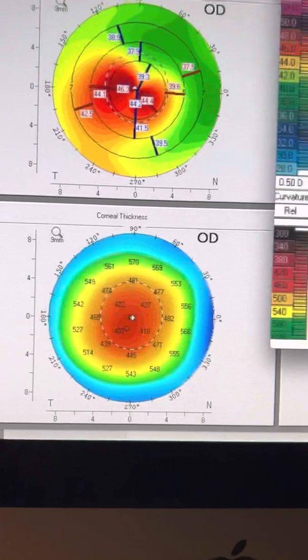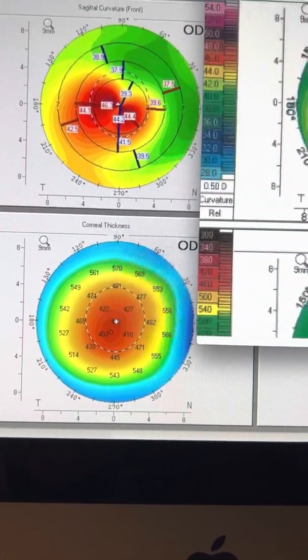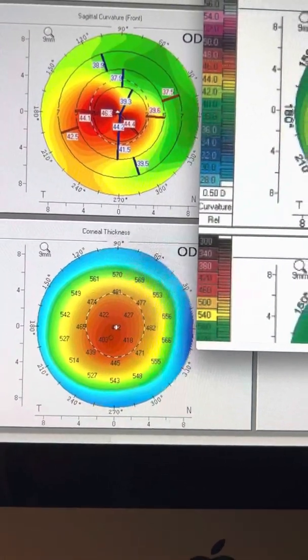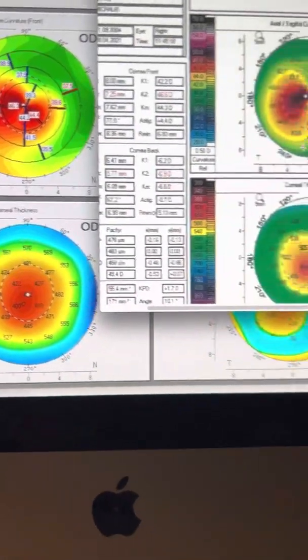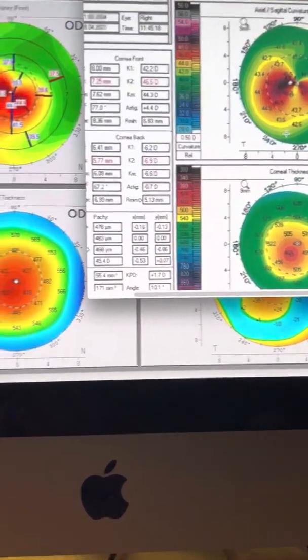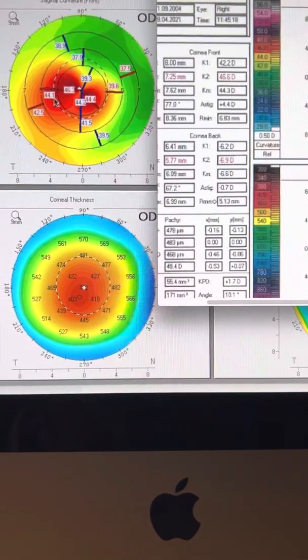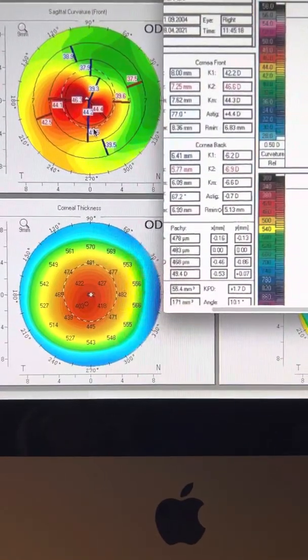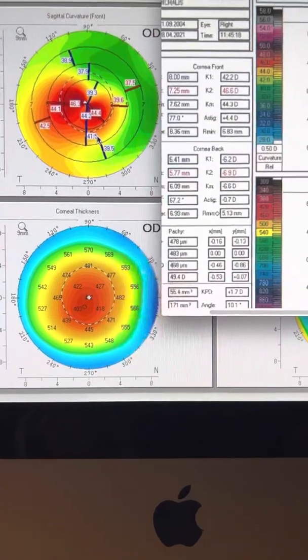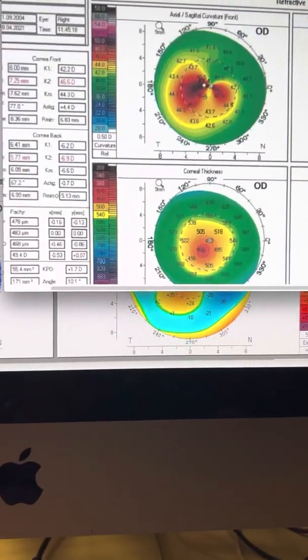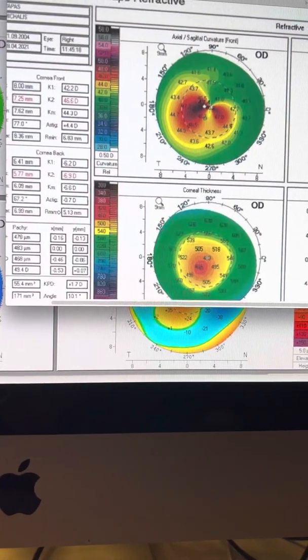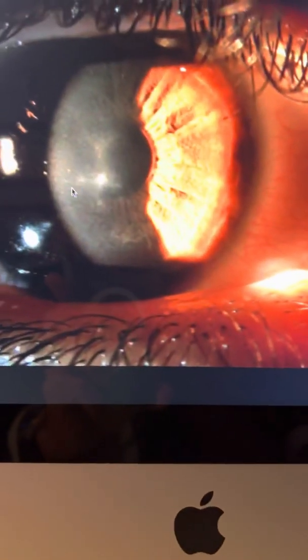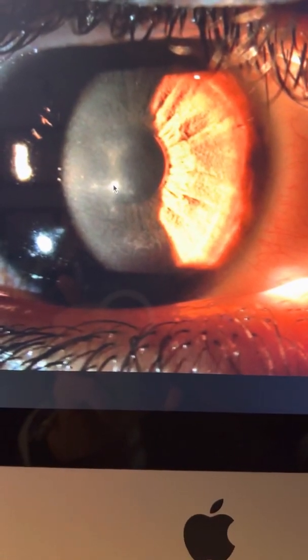We can see that the cone has improved dramatically. We will alter a little bit the treatment in order to see if this will give us further flattening, because we feel that the corticosteroids here may be adding, if anything, to the toxicity instead of helping remove this peak of haze.